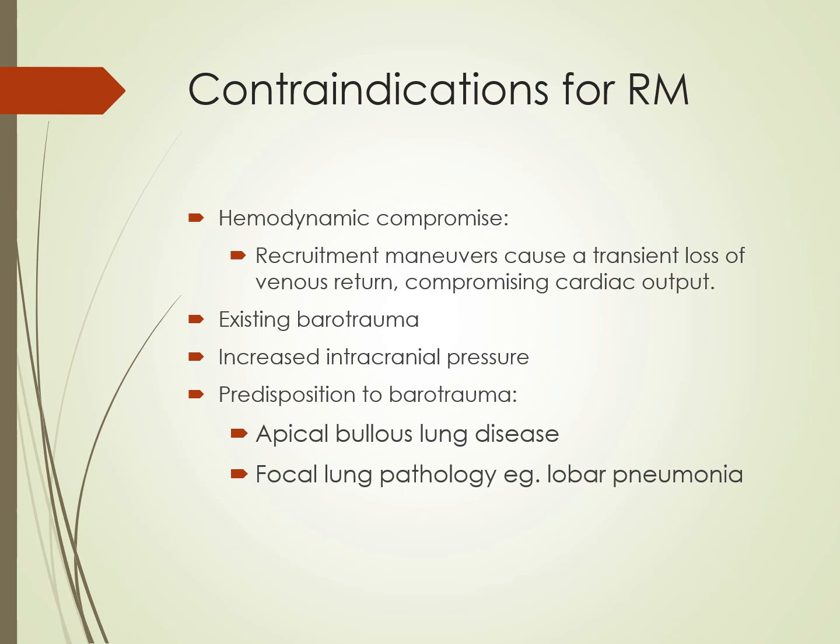There are some contraindications to a recruitment maneuver, and some of them are hemodynamic compromise, existing barotrauma, increased intracranial pressures, or a predisposition to barotrauma. When you start a recruitment maneuver, you have so much PEEP, so much pressure on the lung, that it impedes venous return, thereby compromising cardiac output.